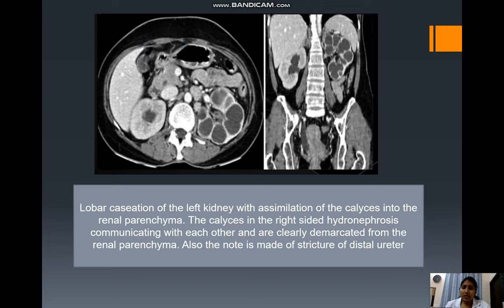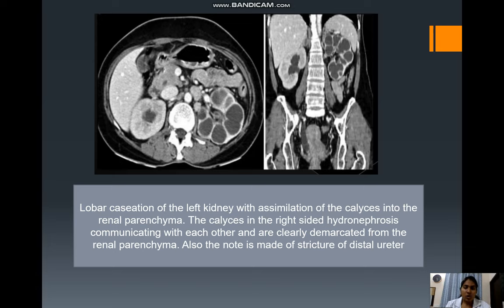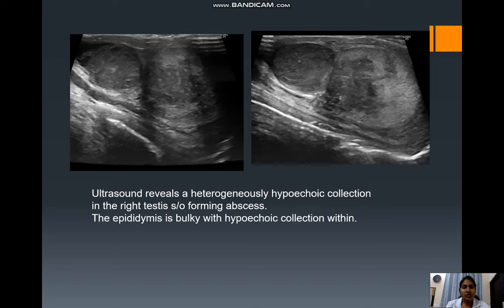This image shows lobar caseation of the left kidney with assimilation of the calyces into the renal parenchyma. The calyces in the right-sided hydronephrotic kidney are seen to communicate with each other and are clearly demarcated from the renal parenchyma. Note is also made of stricture of the distal ureter. All these images reveal genitourinary tuberculosis in different stages.